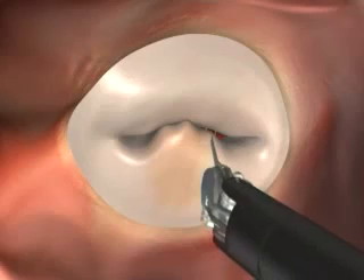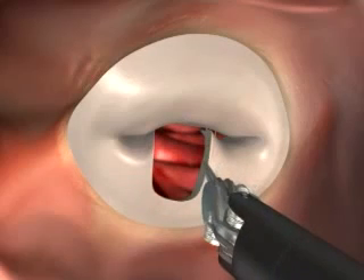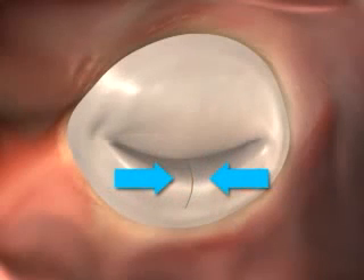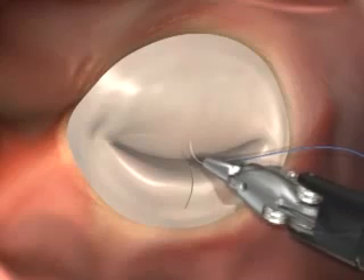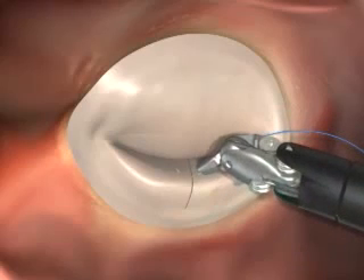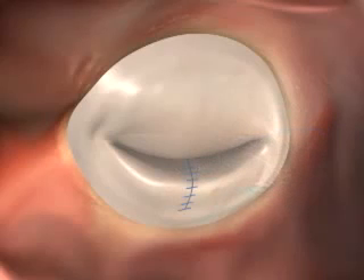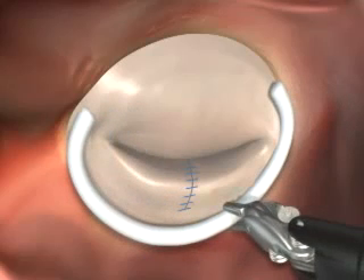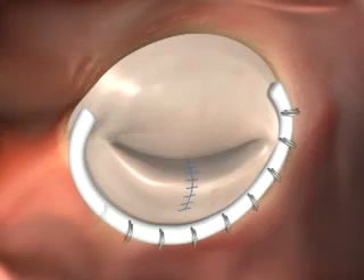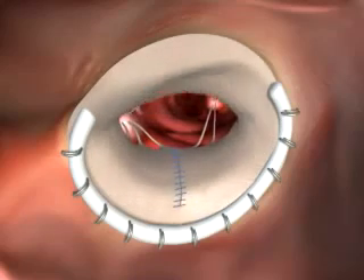We remove the misshapen portion of the valve and reconstruct it with sutures. We insert an artificial ring to reduce its size. We sew the ring into place and the valve now closes properly so blood no longer leaks back.